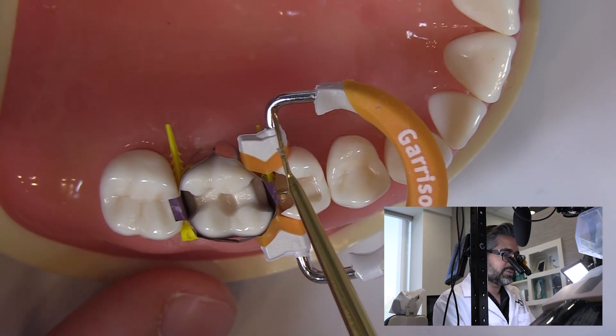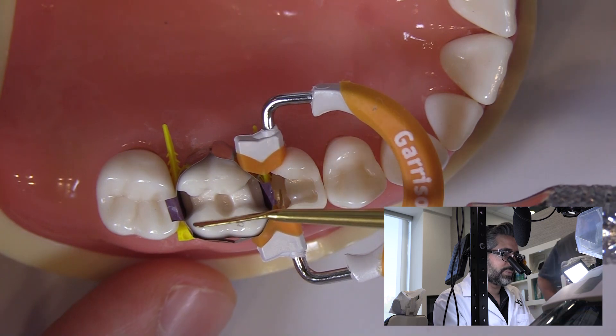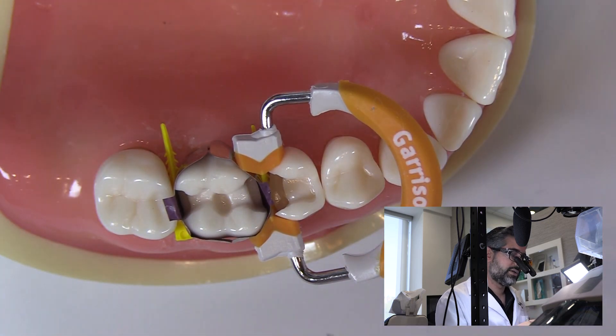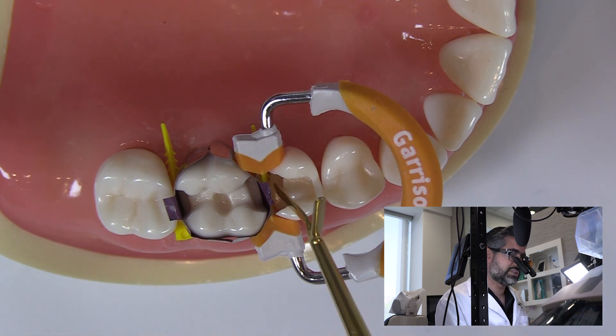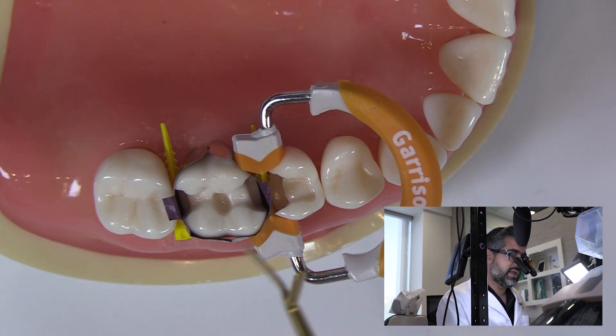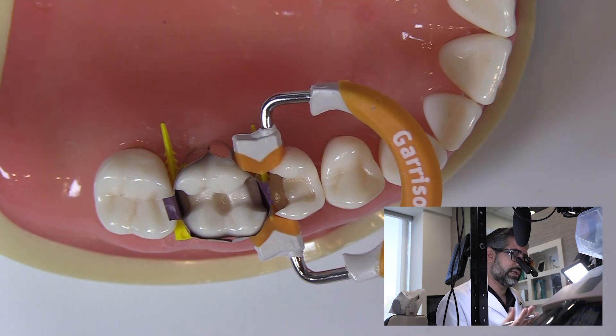I've tried placing another matrix band in here to hold this contour, but I usually find there's too much going on. I really do like to take a 12 blade and finish this margin. If I'm using two matrix bands — a technique that does both sides at the same time — I usually end up trying to favor convenience over quality. And I'm really in favor of trying to get the best quality, even if it means a little more work or a few more steps.